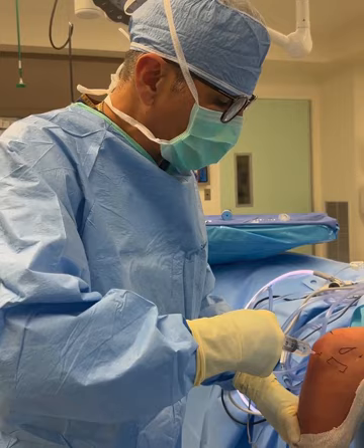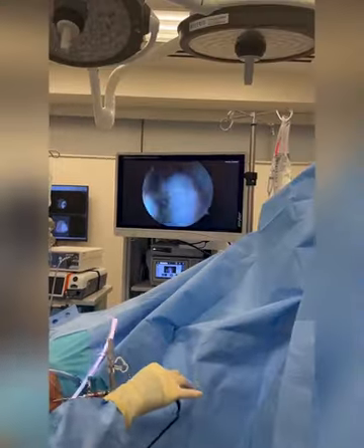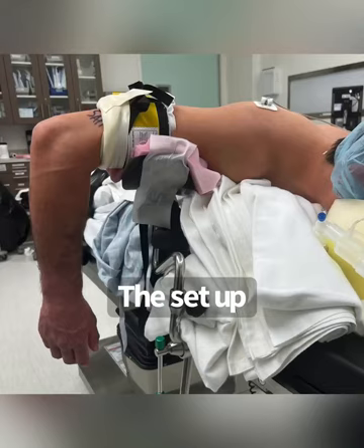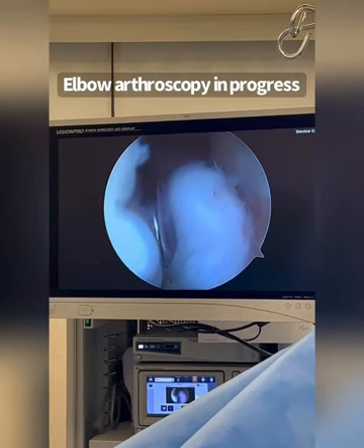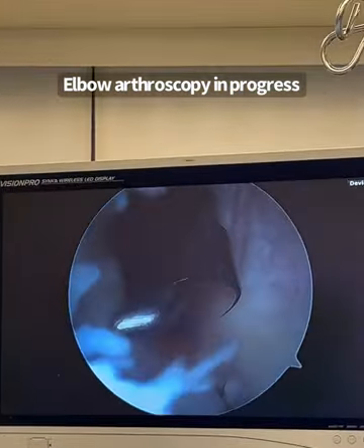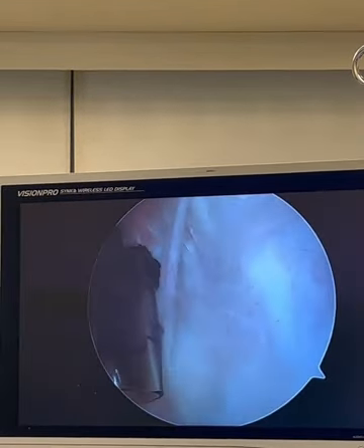I'm doing elbow arthroscopy. I have my camera with a light source and a pump on this side. The patient is face down, looking down, with the arm dangling off the side of the table. You can see the probe, and I have this plastic cannula that allows me to move instruments in and out while maintaining the pressure inside.